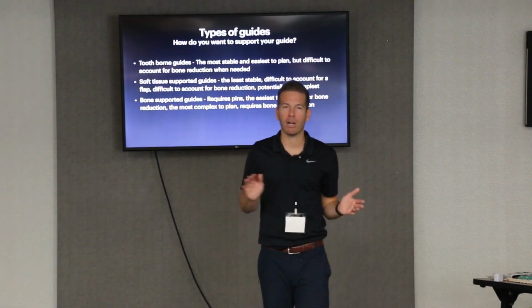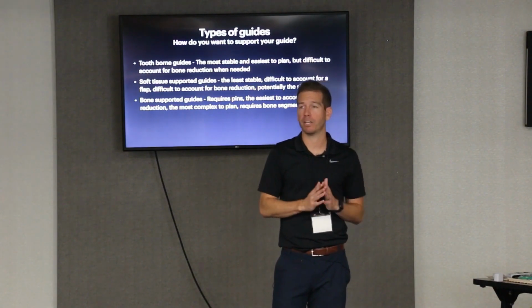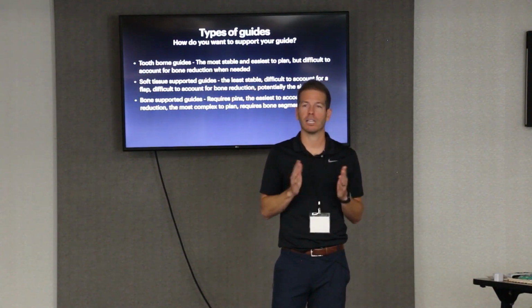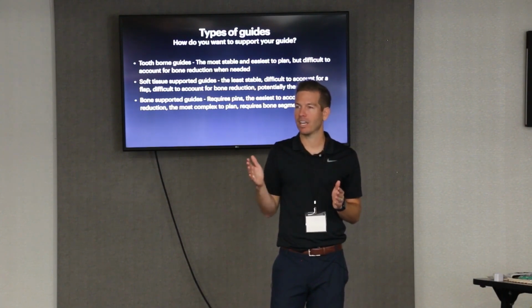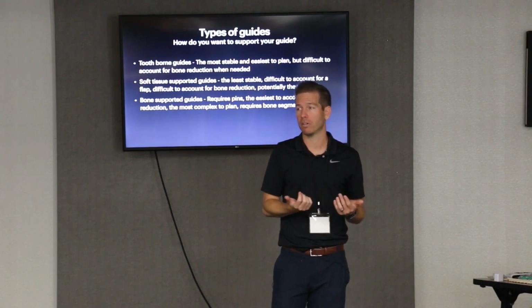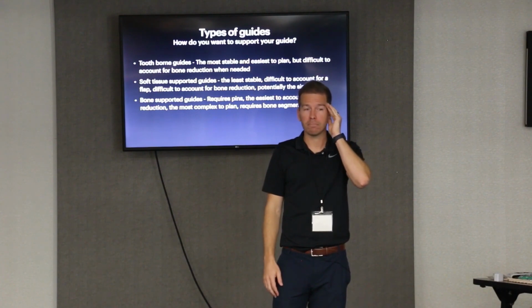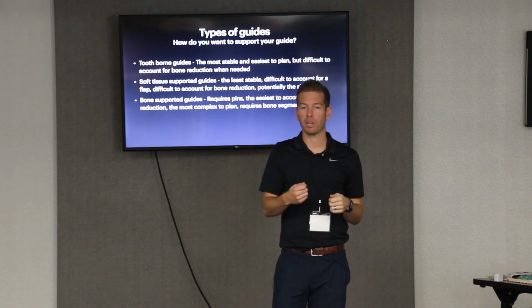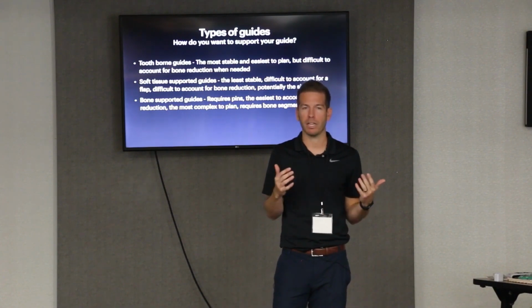So awesome way to do it. That has been by far my favorite way to do full guided cases, just selective tooth extraction. So you got to digitally extract those in between teeth and then build your guide, but pretty simple. It's not really any different than what we're doing already for immediate implants. It's just doing multiple of them. And then implants go in, take your guide off, pull the last 4 teeth, and you're done. And the implants are all in.